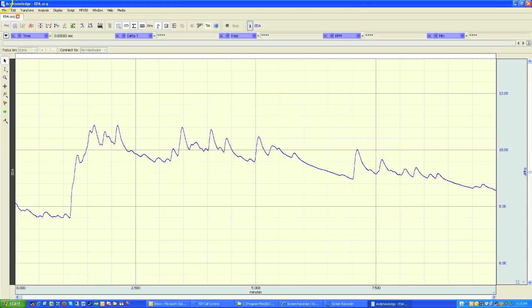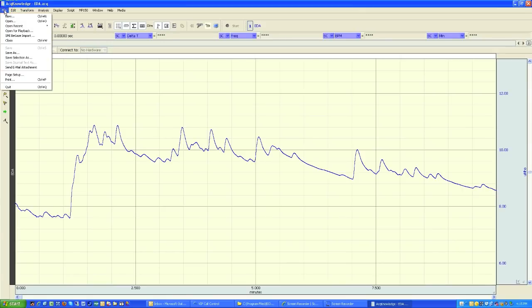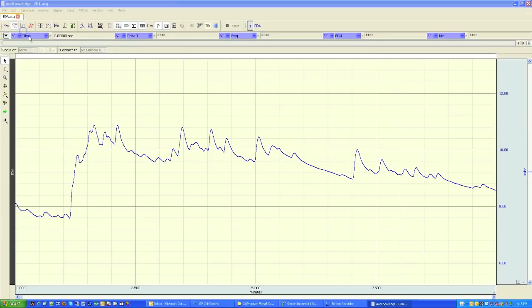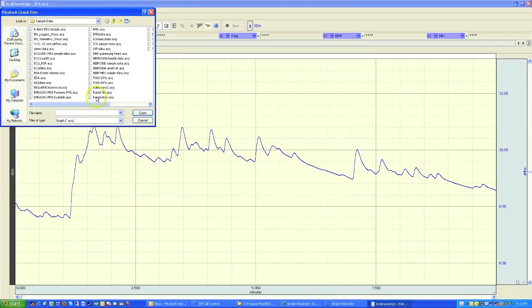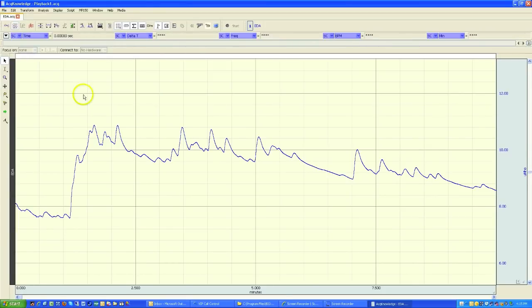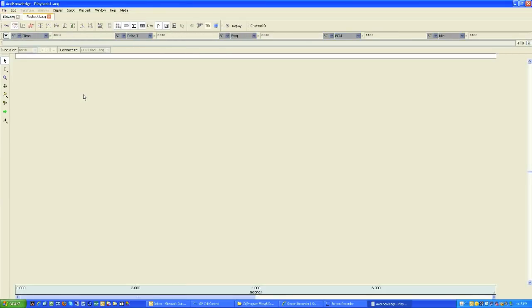In this demonstration, I'm going to open up a file. So I'm going to the File menu to the Open for Playback option and I'm going to replay this ECG Lead 2 file. And the software opens the file just as if you were about to record it for the first time.